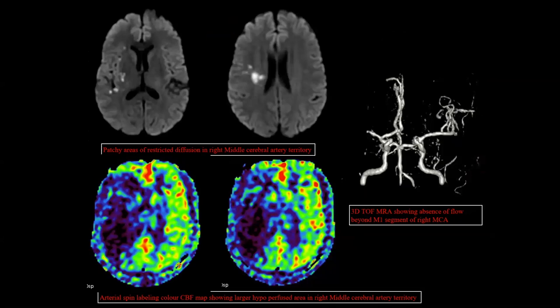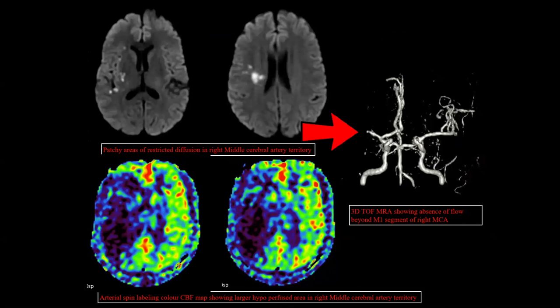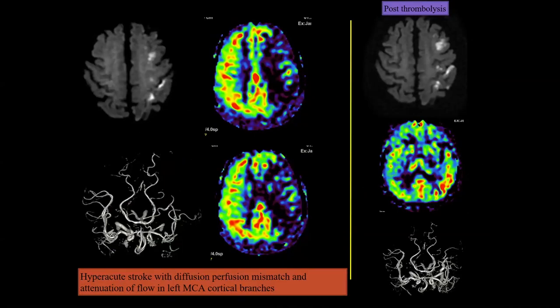Looking at clinical examples: in one patient, small patchy areas of restricted diffusion are seen in the right corona radiata and insular cortex subcortical white matter. On ASL color maps, a larger area beyond the restricted diffusion is hypoperfused, signifying perfusion-diffusion mismatch. On angiography, near-complete cutoff in the right MCA territory is seen. In another example, small patchy areas of restricted diffusion are noted, and post thrombolysis the hypoperfused area shows successful restoration of perfusion with stabilization — no significant increase in the size of restricted diffusion, saving a lot of salvageable penumbra.